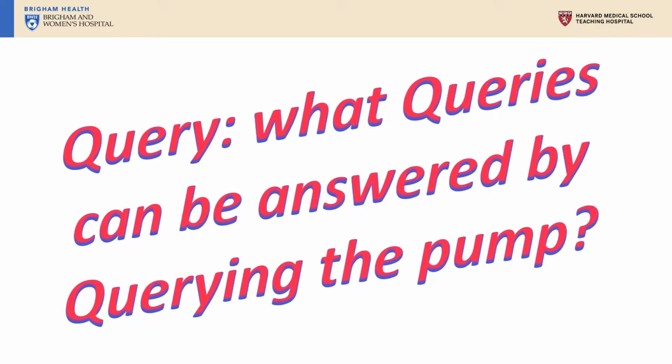I imagine the title of this talk makes many of you ask a query. What queries can be answered by querying the pump? Maybe not in so many words. Likely more along the lines of, why should I bother knowing how to get information from the PCA?